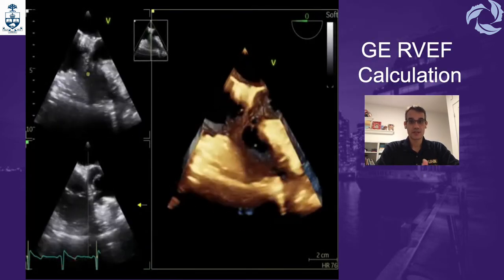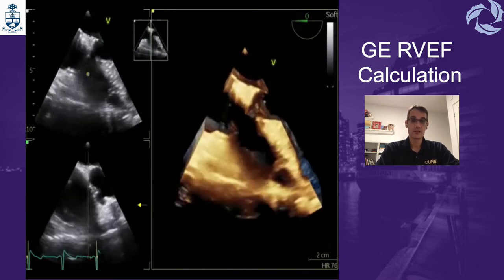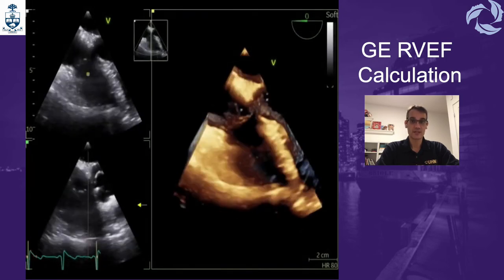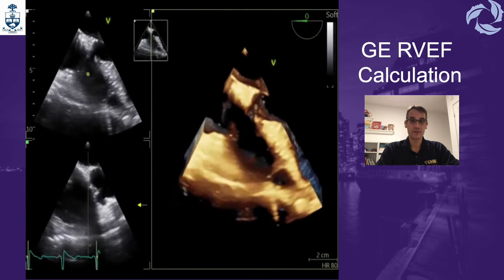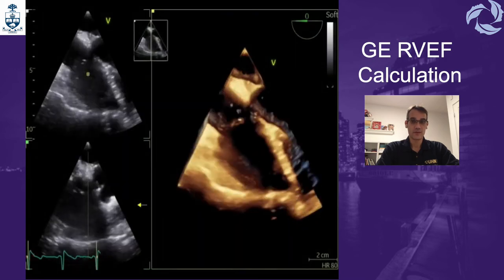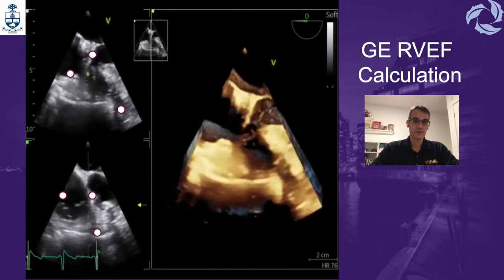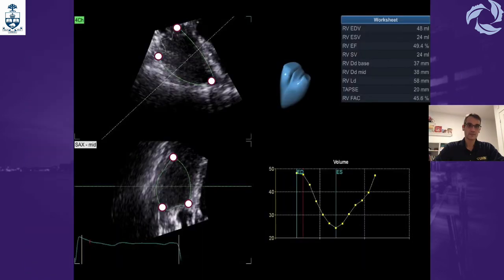To repeat the same process for the right ventricle on the GE Vivid E9, the advantage is that the Vivid offers a dedicated 3D software specifically for the right ventricle developed by TomTec. You will be asked to position reference points as per the instructions, and once the points are situated, the software will calculate the 3D right ventricle ejection fraction, TAPSE, and fractional area change using 3D technology.